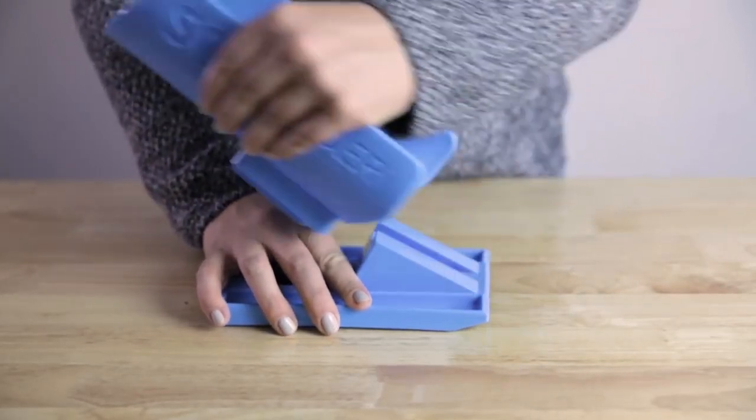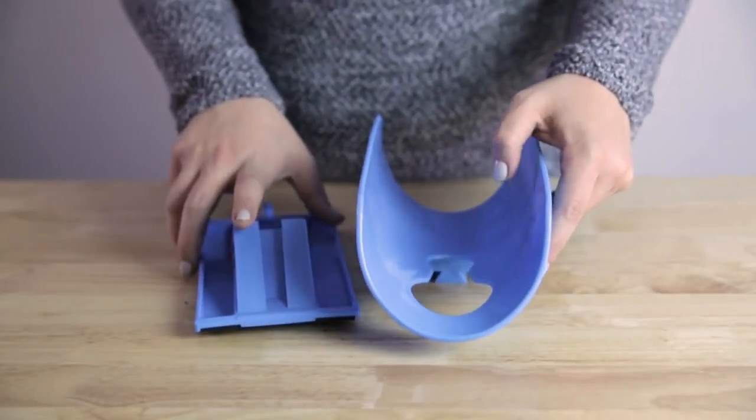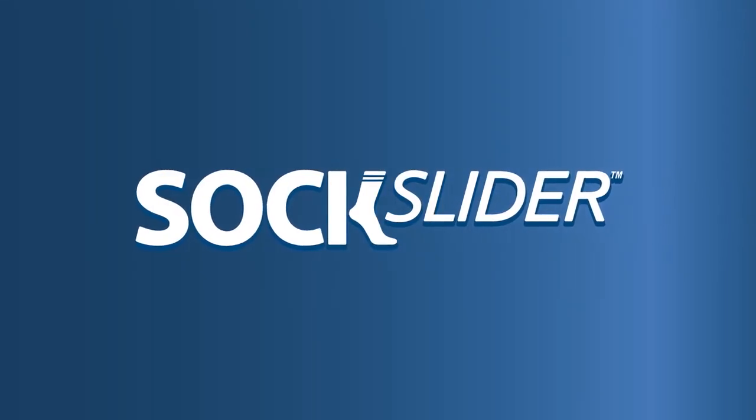To disassemble, firmly grasp the Sock Slider system base while pulling up on the sock cradle so the cradle detaches from the base. For more tips and tricks, please visit www.sockslidertips.com.